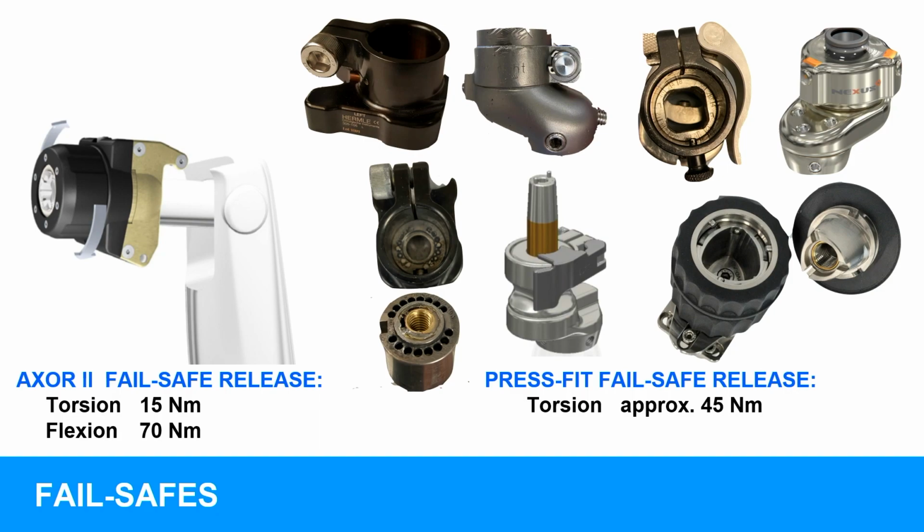And then the press fit systems only have fail-safes in transverse plane rotational forces. Most of the press fit implants release at about 45 Newton meters. There are some, including the German ESKA system, that is adjustable based upon the patient's weight.